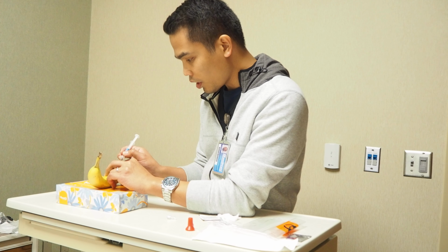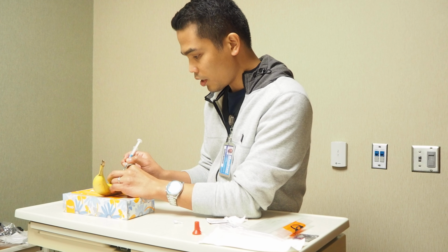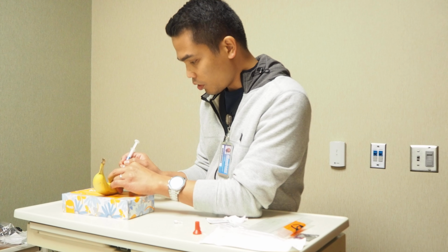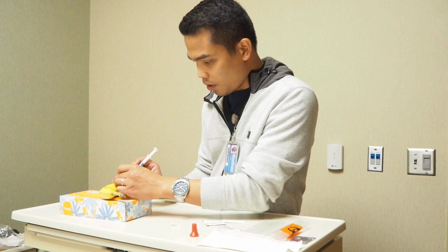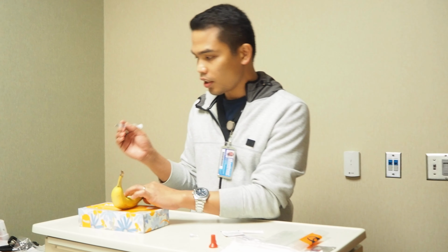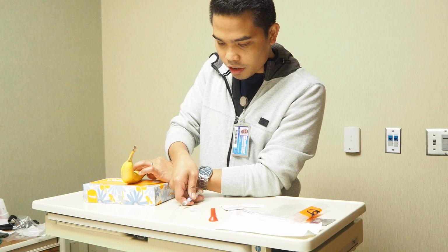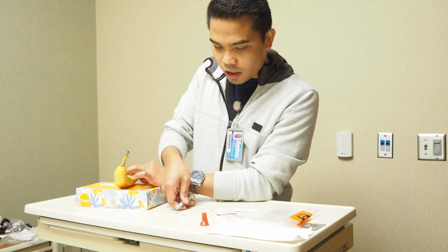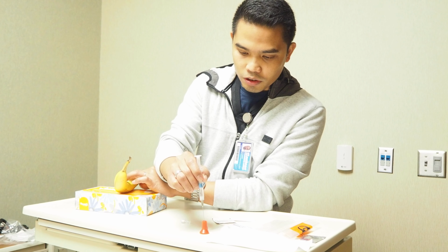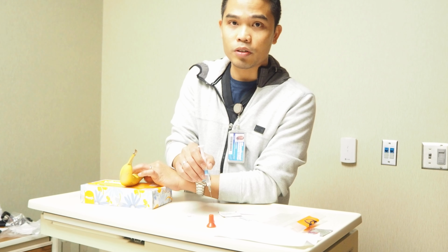So I'm going to push it through right away. I need to ensure that my fingers are away from it to prevent any accident of poking myself. Once I'm done, I'm going to prepare the gauze, remove the needle, and apply pressure for at least 3 to 5 minutes. If possible, with another gauze, we have to remove a little bit of air or even tiny clots by pushing it through this red cap. After we push this one through, we have to remove the needle together with the cap and dispose of it directly in the sharps container.